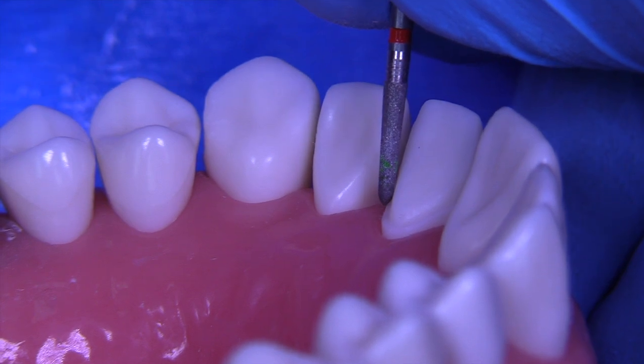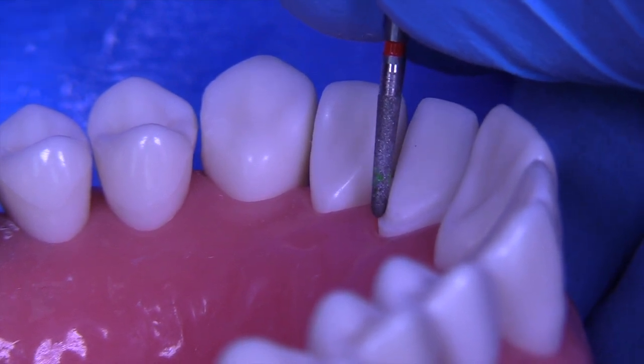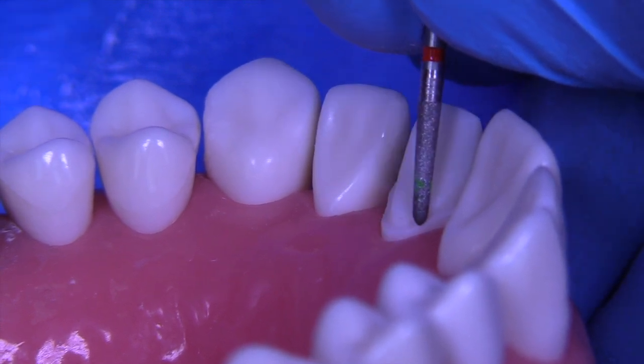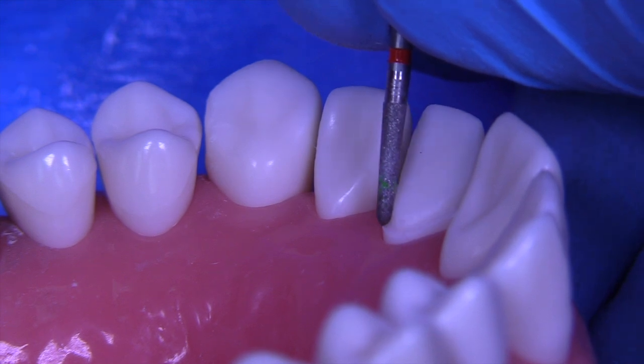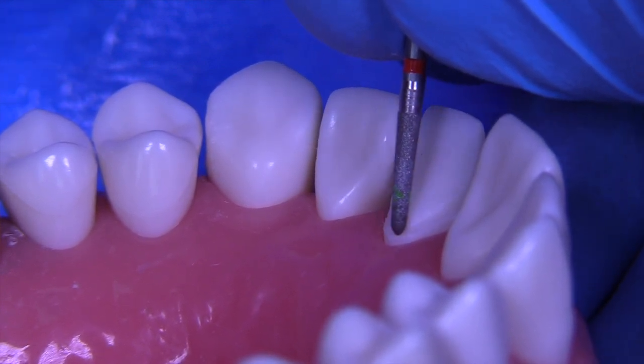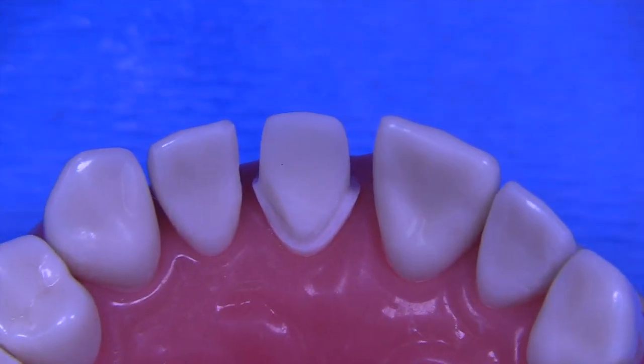The shape you have developed on the lingual looks more shoulder-like or fillet-like. It doesn't look like a chamfer with a downward declination angle. It's close, but not exactly right. So I would definitely want to use an 8878K 016 to create that particular situation that we're looking for.